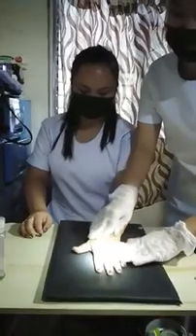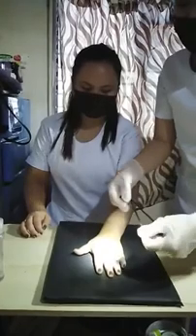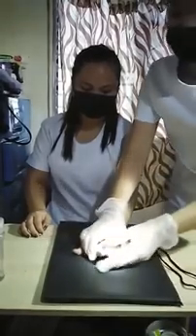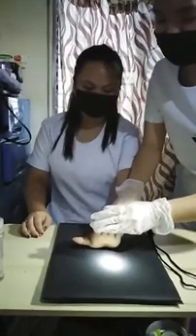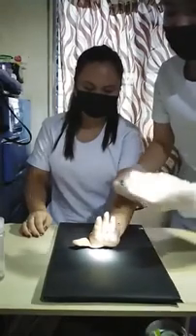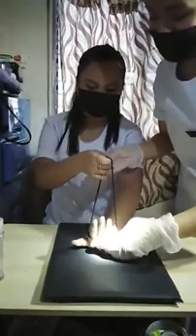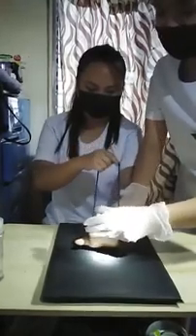Part position, hyperextend the wrist, center the joint at the area of the radial styloid process to the mid portion of the image receptor. Make the long axis of the hand as vertical as possible without causing pain or discomfort. Slightly rotate the hand towards the radial side to prevent superimposition of the hamate and pisiform shadows. Hold the wrist in an extended position by having the patient or someone grasp the digits, either by using the opposite hand or using a device.